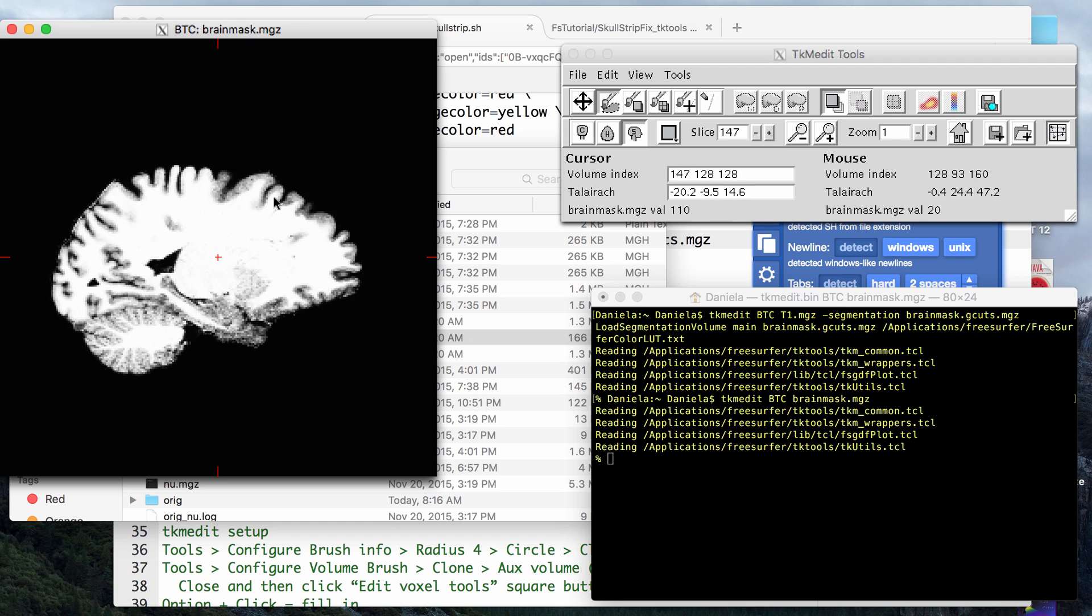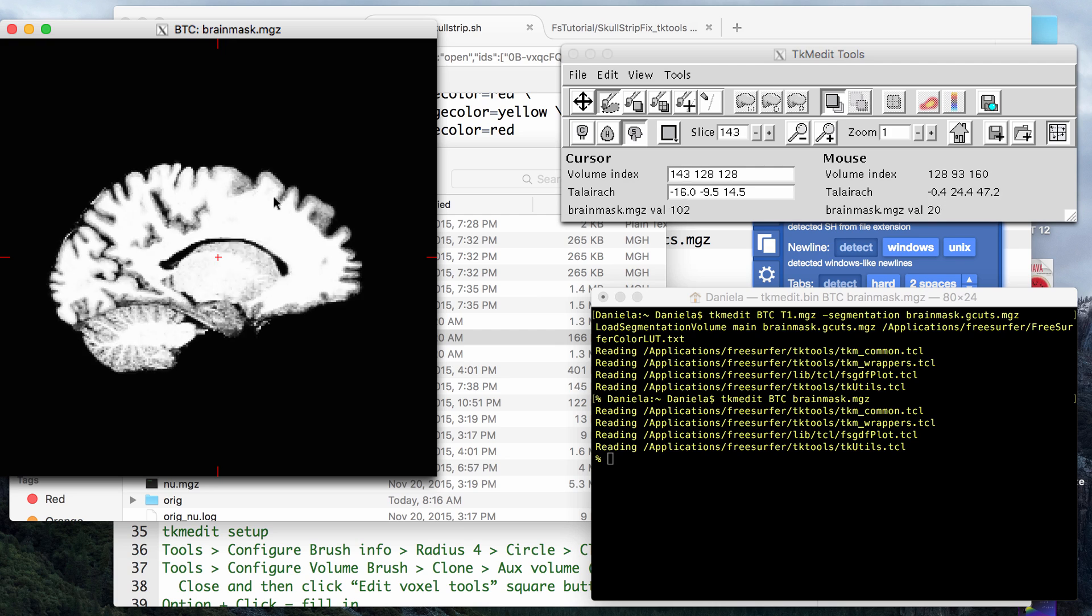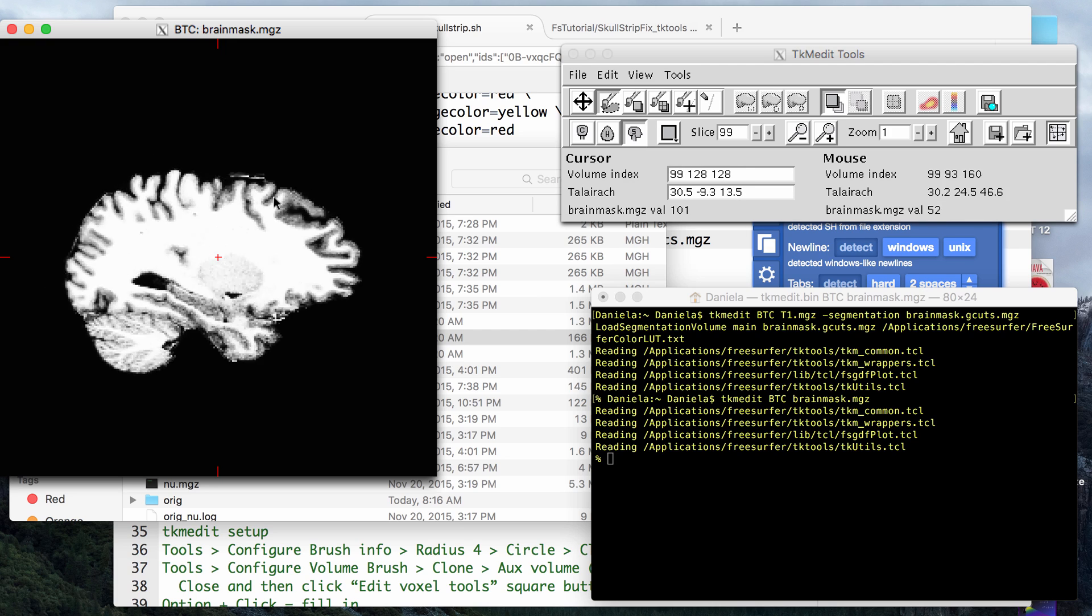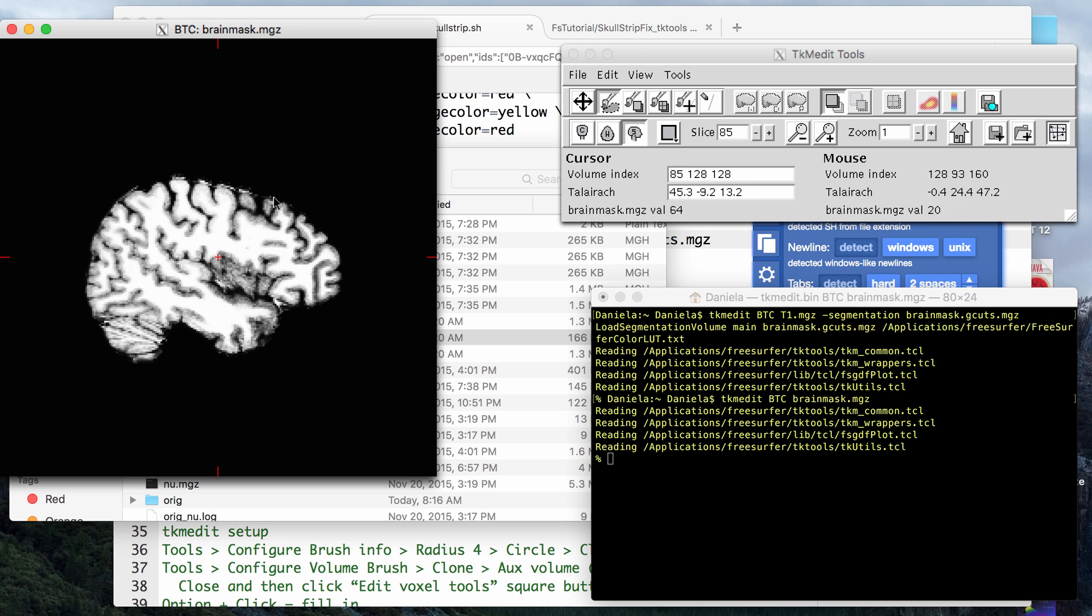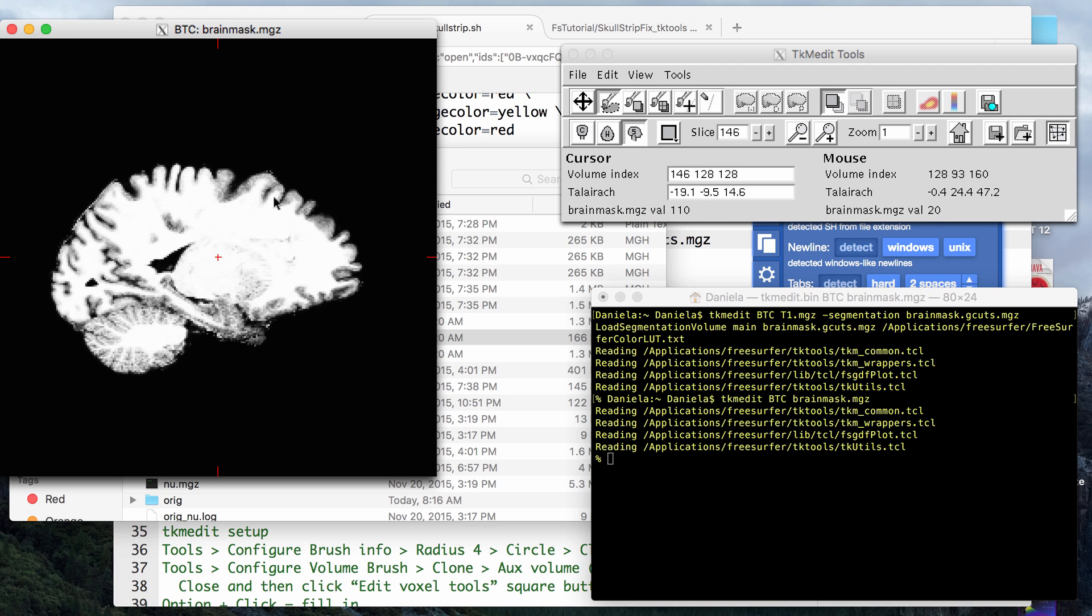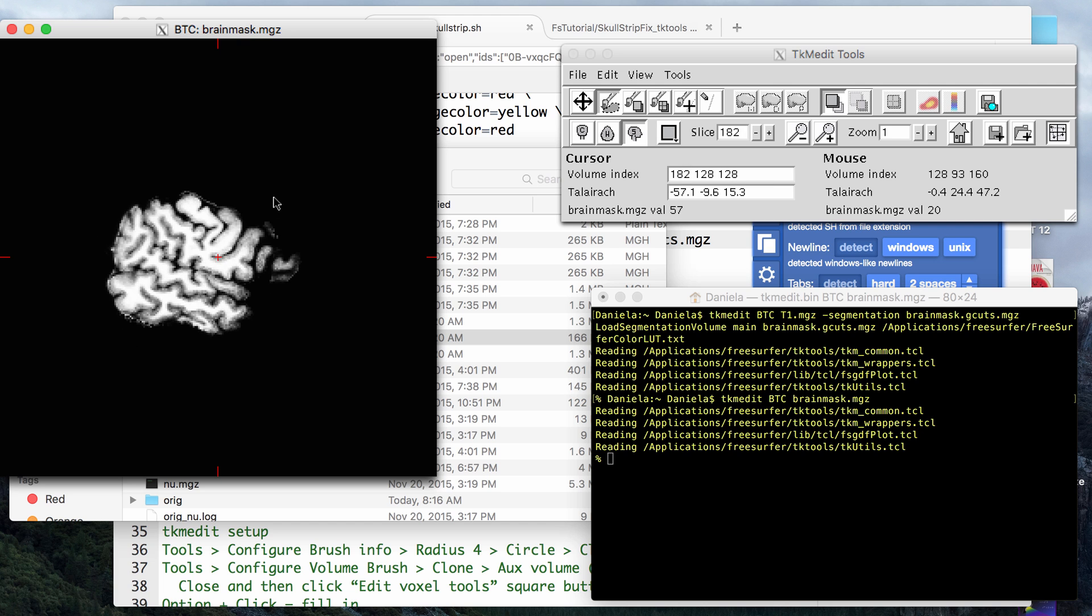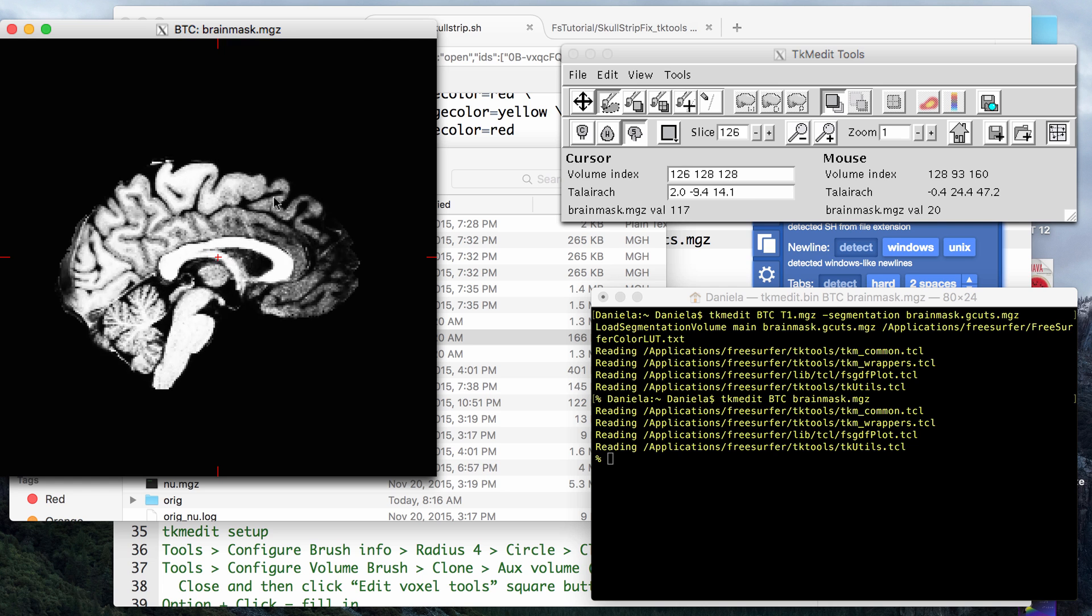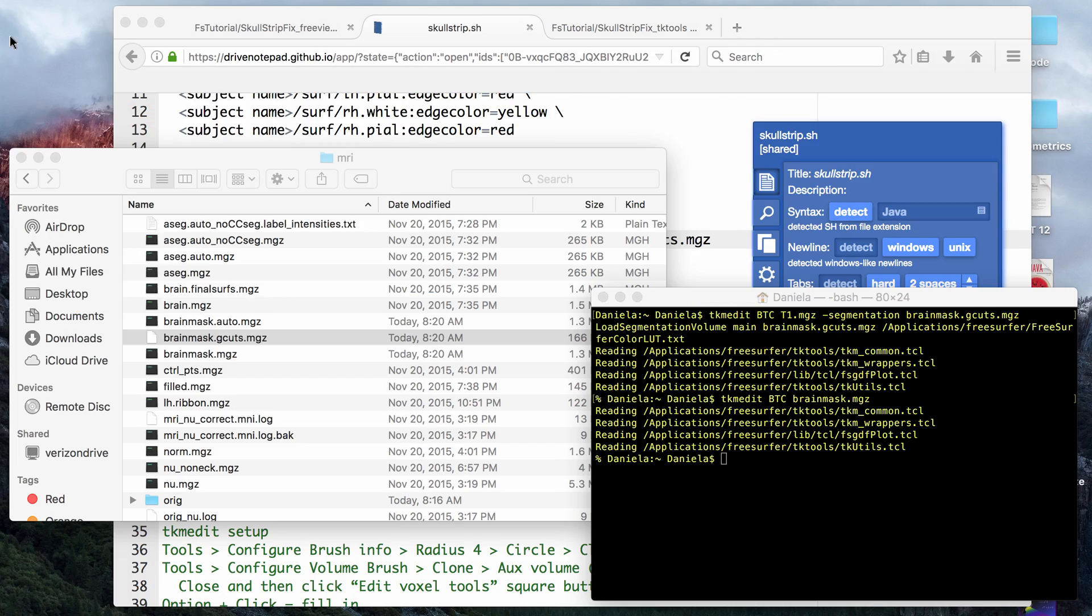You can see that a lot of the dura matter is removed now. If you read the graph cuts paper that I showed before, it says that it removes about 10 to 30 percent more dura matter than the normal recon all does. I think that looks pretty good. You can go back in, and like I said in the beginning of the video, it's recommended that you go back in and do some manual edits, but it should be a lot faster because if you look at this brain mask, it looks pretty good. Okay, so that's gcut.